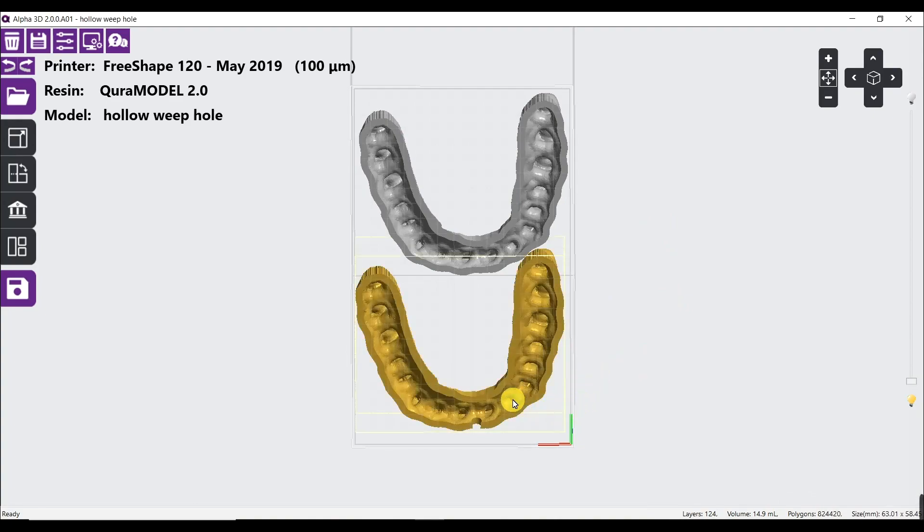What is a weep hole? Let's look at the screen. We can think of it as a pressure release point, which will increase the print success rate. But if we don't have a weep hole, then we will need to add support. We can do it like this.